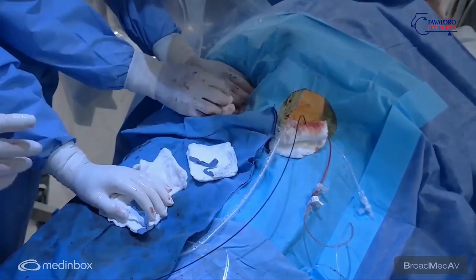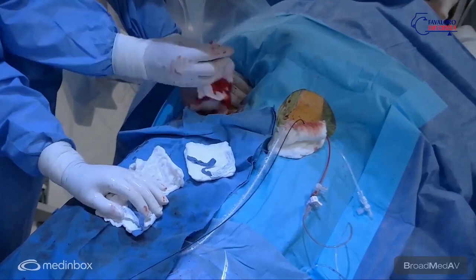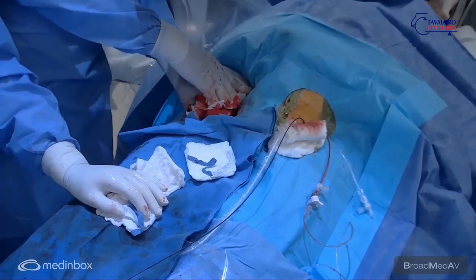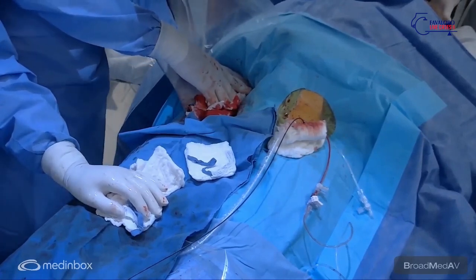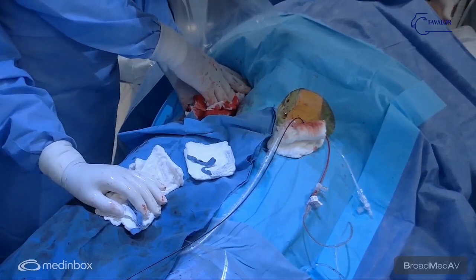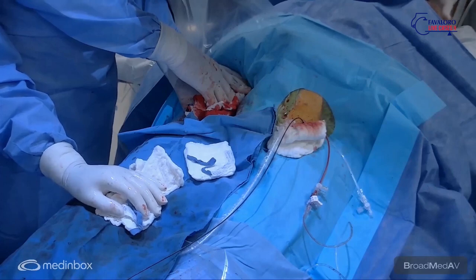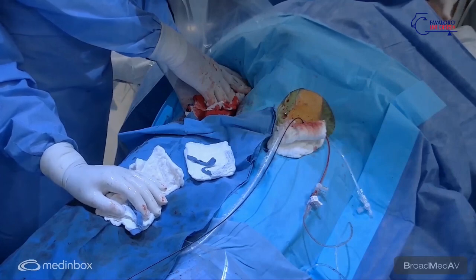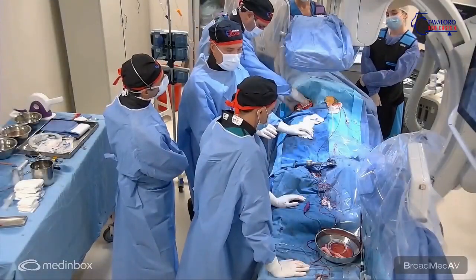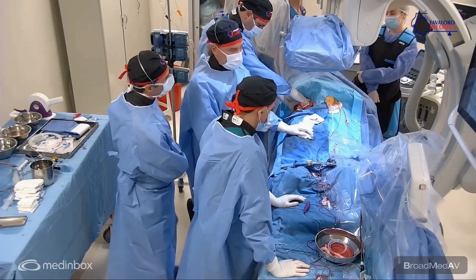So here we will leave the balloon for 3 minutes. In case we have bleeding, we can think about putting a covered stent. So this is the patient that we never think about surgery because she's too big. The possibility of having complications with surgery is very high, lymphocele, infections. We have had experience. So it's much better to deploy a covered stent and finish the procedure. And the patient for sure is going to go very well.